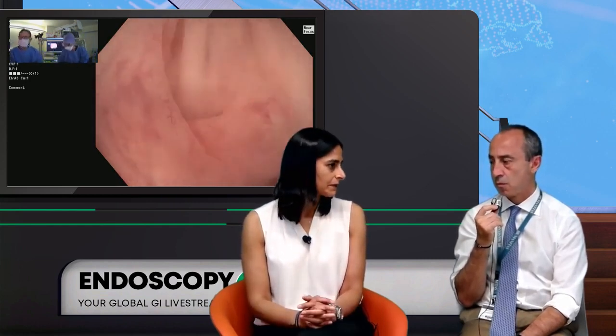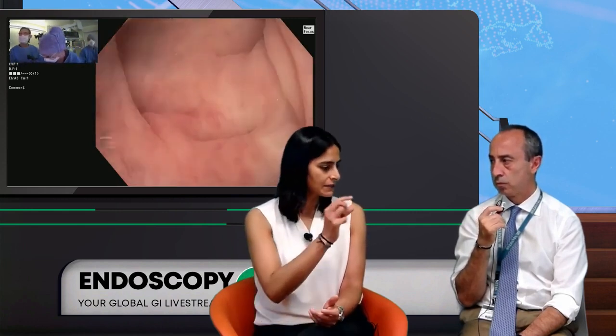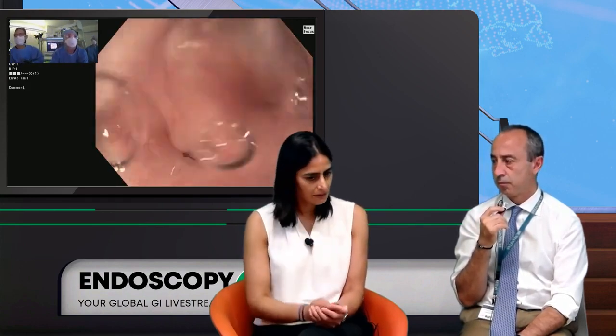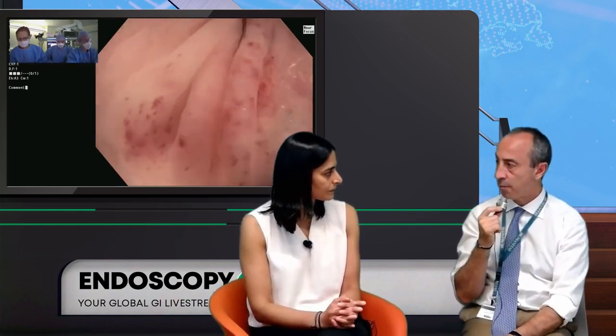The double channel would allow you to have a little bit better suction, but the suction is actually within the catheter itself. So it's really sucking up the material that gets cut. So the concept is a blade, a rotating blade. So whatever is the contents, it can be used, no?